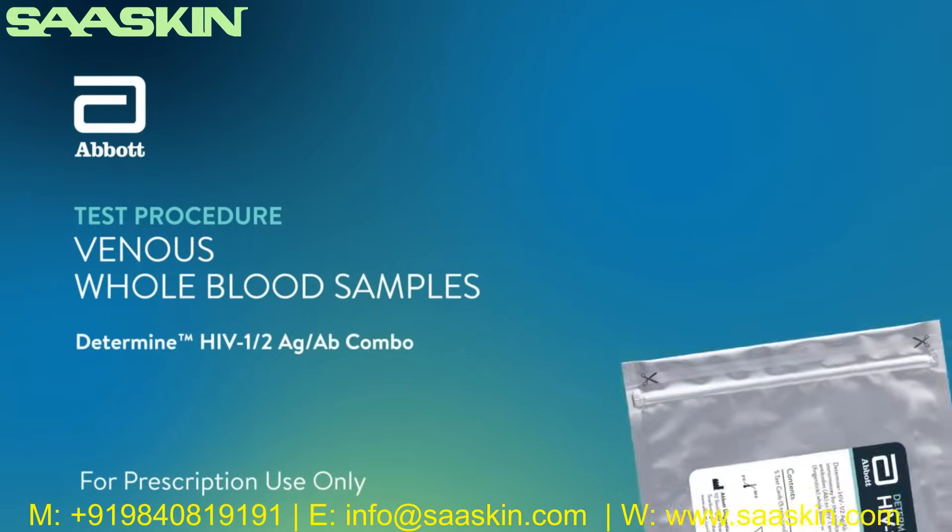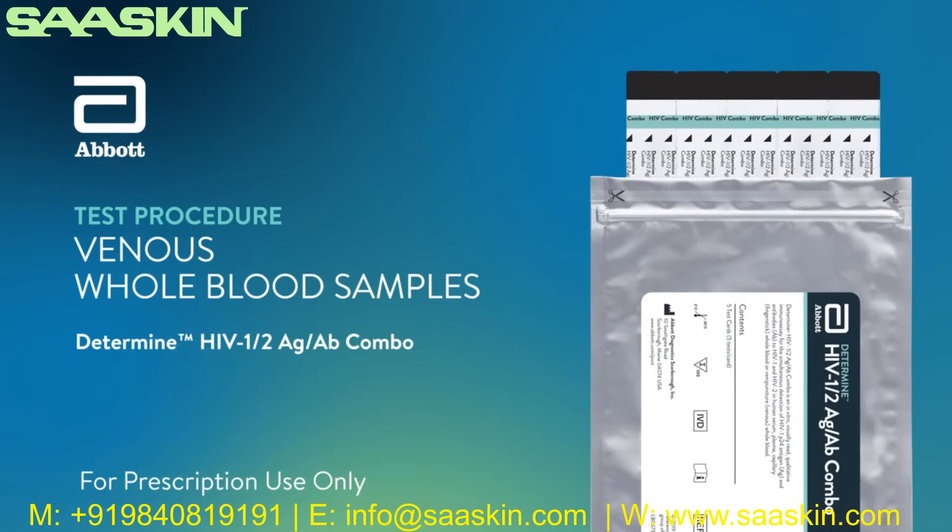The Determine HIV-1-2 Antigen-Antibody Combo Procedure Training for Venous Whole Blood Samples. The Determine HIV-1-2 Antigen-Antibody Combo is an immunochromatographic test for the simultaneous and separate qualitative detection of free HIV-1 P24 antigen and antibodies to HIV-1 and HIV-2 in human blood.